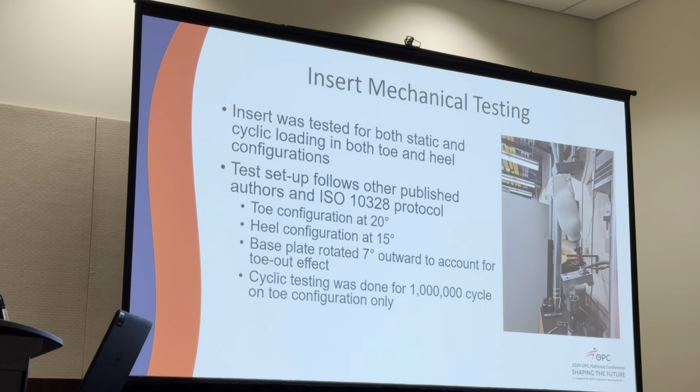Once we had the printing parameters chosen, we went ahead and 3D printed the insert. For the mechanical testing, while we were creating the protocol, we didn't really know how to test the insert on its own because this is a completely new device. There's no protocol or any research into how we would like them to function. So we went ahead and integrated it into a socket and tested the insert-socket as just a regular socket. We used other published articles and the ISO protocol for lower limb prostheses.